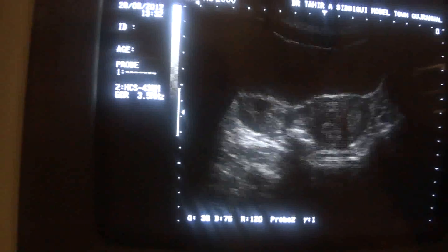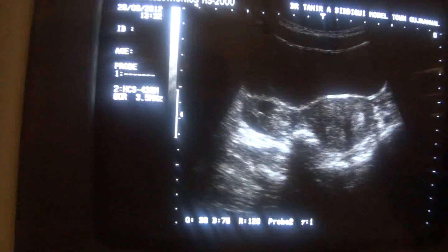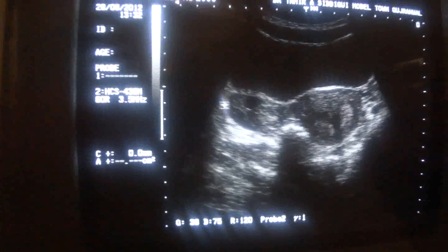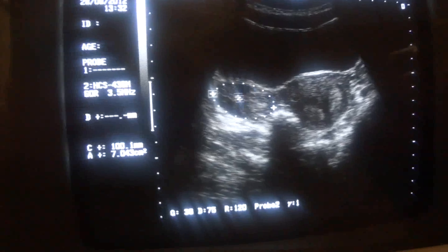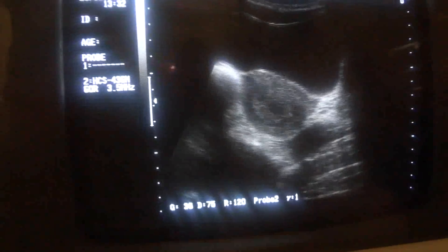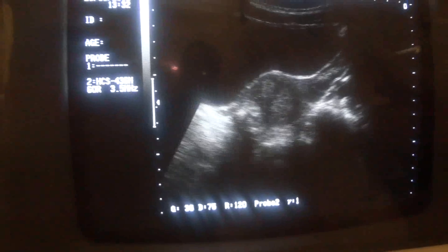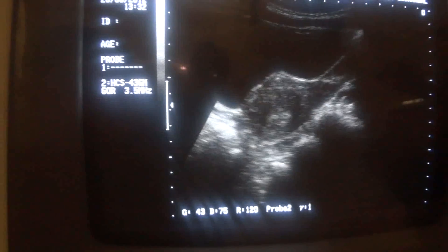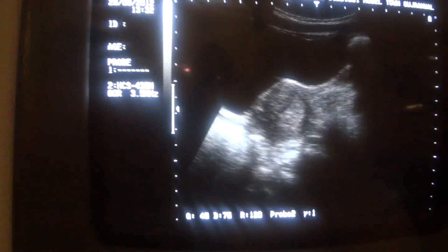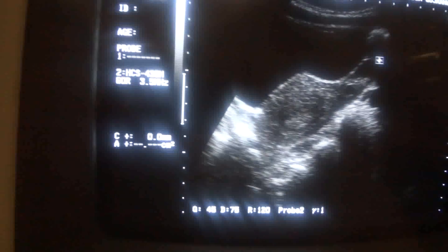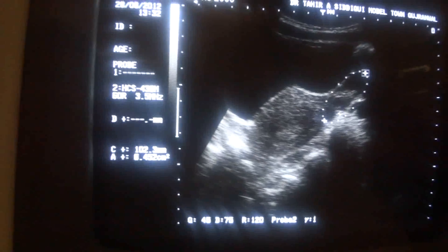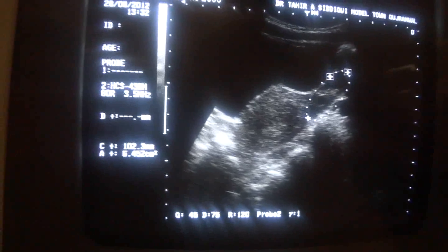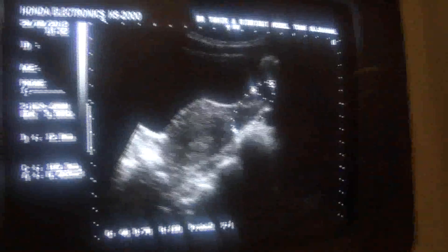Now let's have a look at the ovaries. This is the right ovary, with a follicle clearly seen. Here is the left ovary — you can see the follicle activity. These are the follicles. The largest follicle measures 12 millimetres.